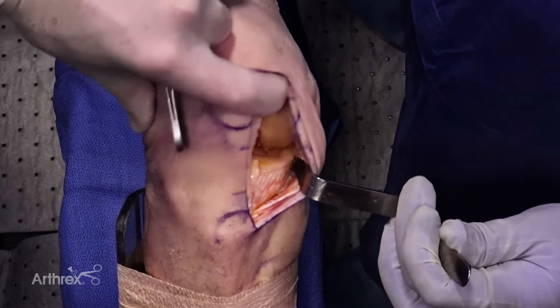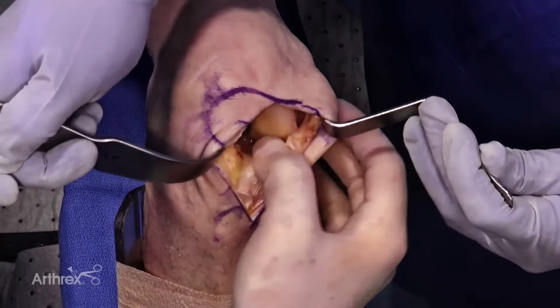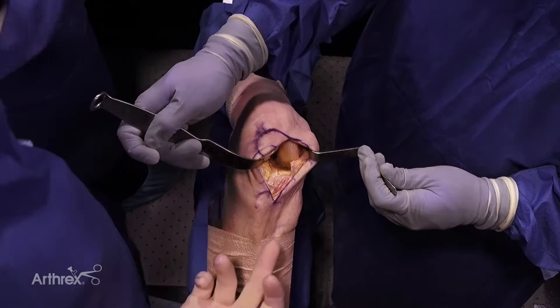With that little 45-degree snip into the VMO, it allows the patella to be very mobile, and you can move that. We call this a mobile window — the skin incision is small, but I can move the patella around. Typically I'll use a Z retractor, and now we have access to the whole medial joint. So that's our exposure: limited incision, minimally invasive.